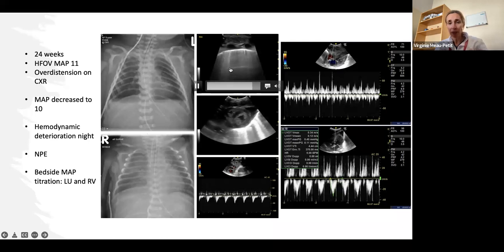A lines, which for me, when you see them too well on HFO, is a sign it's slightly over-distended. But most importantly, we had a significantly decreased flow in the main pulmonary artery, a bidirectional flow through the PFO, and a mean velocity in the ascending aorta which was extremely low.